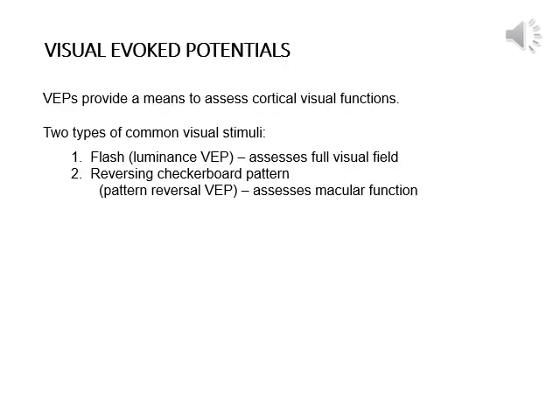Visual evoked potentials are a way for us to assess cortical visual function. Anything that stimulates the visual cortex can generate an evoked potential. And so anything that has a pattern, a change in contrast, a change in luminance will generate an evoked potential. And so within the research realm, there's many different ways to generate an evoked potential using different sorts of stimulation.